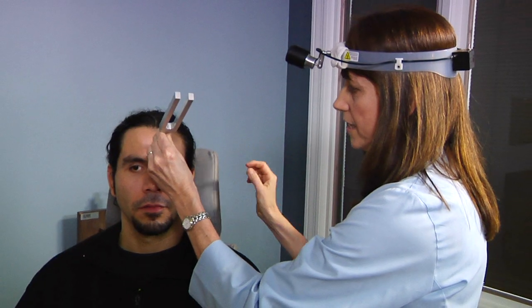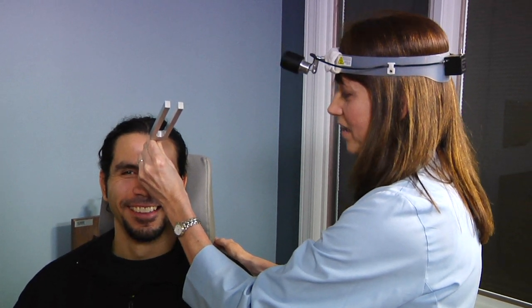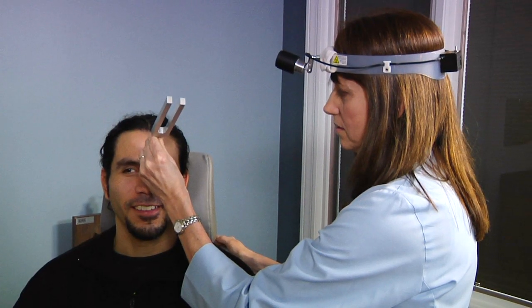In the Weber test, the tuning fork is placed on the forehead, the bony nasal dorsum, or the front teeth. Ask the patient to tell you whether they hear the sound louder in one ear or the other, equal in both ears, or they cannot localize the sound. Classically, the tuning fork is louder in the better-hearing ear in a neurosensory hearing loss, and in the worst ear if there is a conductive hearing loss on that side. The other test is known as the Rinne, in which the tuning fork is placed onto the mastoid tip, and then in front of the ear canal.